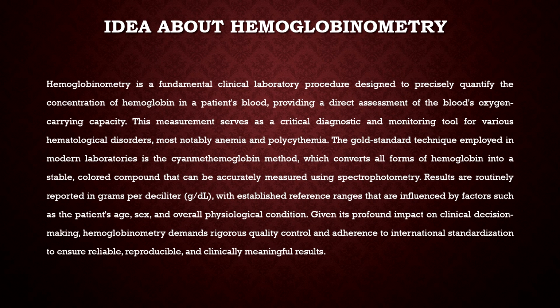Let's have some idea about hemoglobinometry. So what is hemoglobinometry? It is a fundamental clinical laboratory procedure designed to precisely quantify the concentration of hemoglobin in a patient's blood, providing a direct assessment of the body's oxygen carrying capacity. We all know that hemoglobin is the only pigment of the blood which carries oxygen among different parts of the body.